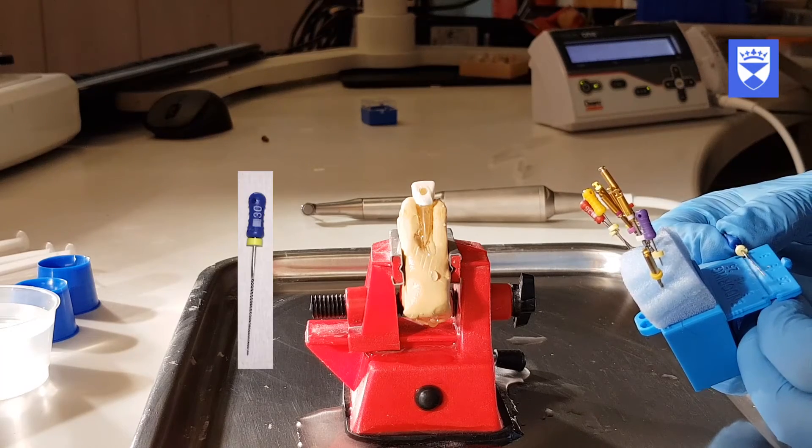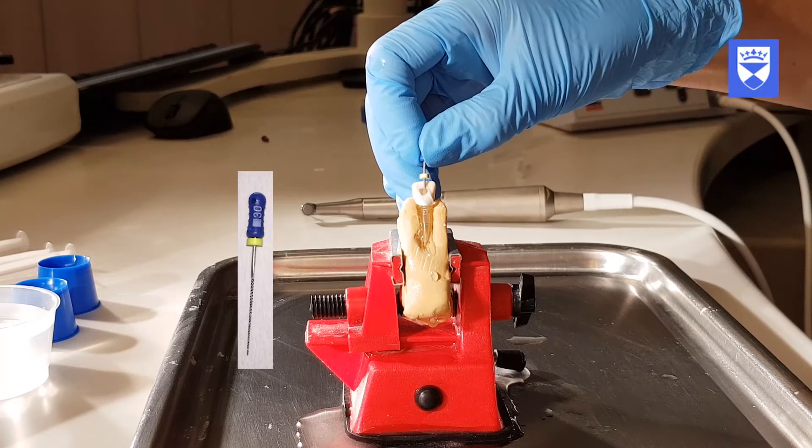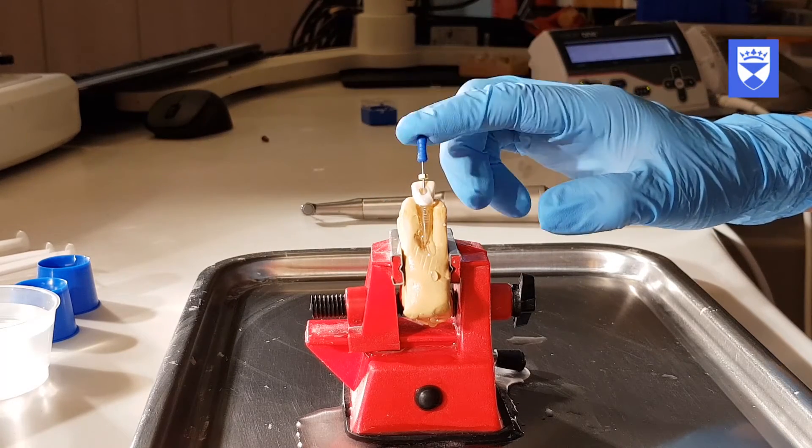Note that the size 30 flexofile sits snugly in the canal and does not move apically when tapped. This indicates that the finishing size of the apical constriction is F3.